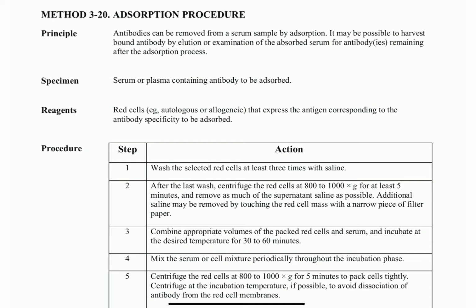The adsorption procedure is quite simple. The theory behind the adsorption procedure is more complex. This week we'll cover the adsorption procedure itself, and next week we'll apply it to actual antibodies.